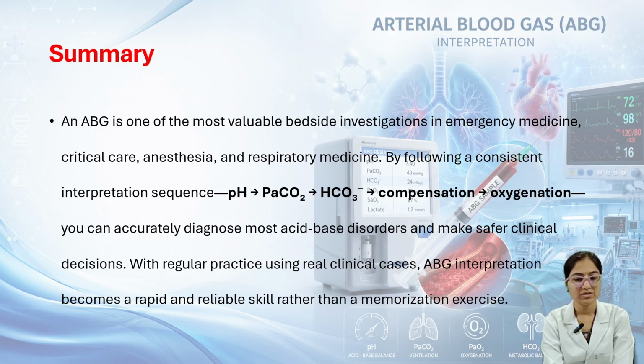At last, we'll see the summary. An ABG is one of the most valuable bedside investigations in emergency medicine, critical care, anesthesia, and respiratory medicine. By following a consistent interpretation sequence, that is pH, PaCO₂, bicarbonate, compensation, and then oxygenation, you can accurately diagnose most acid-base disorders and make safer clinical decisions.